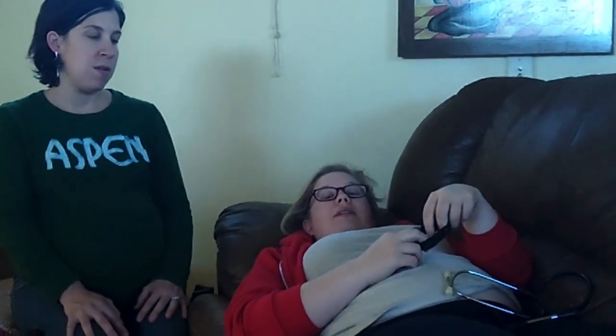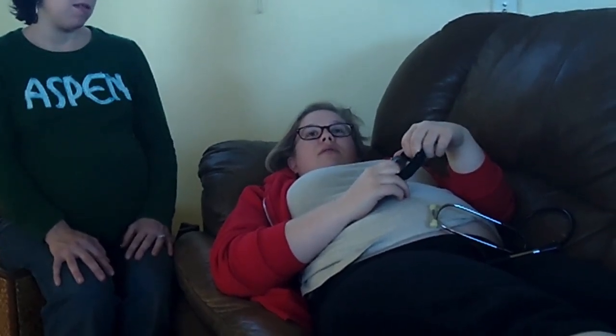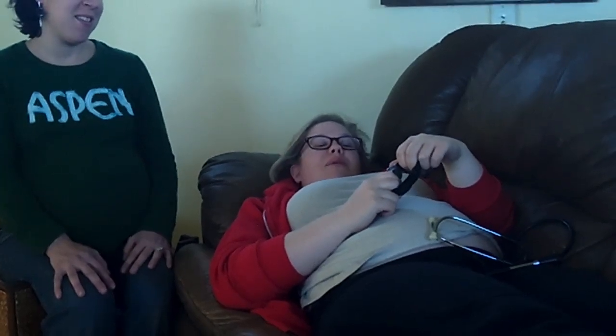The normal range that we're looking for with a baby's heartbeat is 120 to 160 beats per minute. It can maybe be a little faster than that early in pregnancy if you were listening with the Doppler, but by the time you can hear it with the Doppler, that's usually considered the healthy normal range. Fetoscope, you mean? What did I say? Doppler. Oh dear, my brain. So yeah, by the time you can hear it with the fetoscope, that's the range you would be looking for.